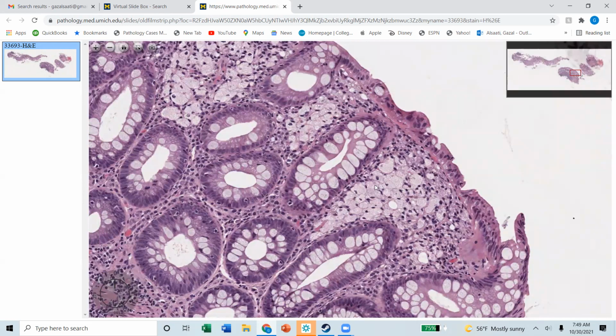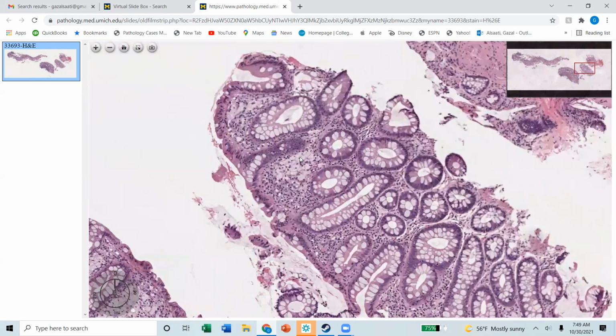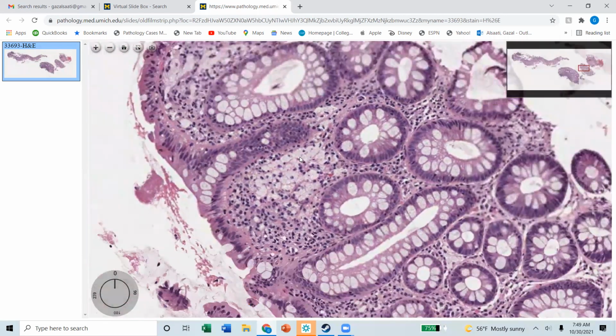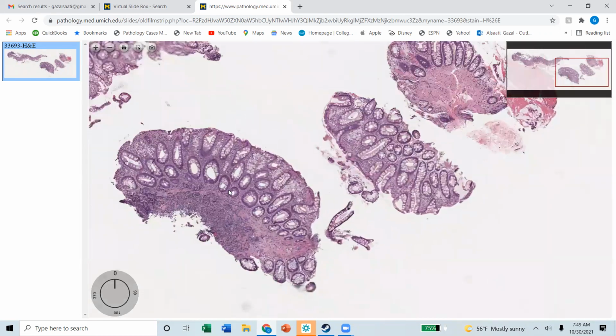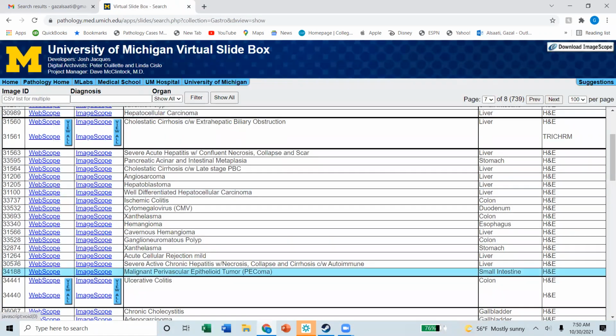These will be keratin negative and CD68 positive, and you'll call this consistent with the clinical impression of xanthelasma. Why don't I just call it xanthelasma? Because surprisingly, even if the doctor didn't see anything, you may see a lot of foamy histiocytes within the lamina propria, and the doctor doesn't call it anything. Not all the time will they be seen clinically, but when they are, they are more nodular like that. Just keratin and a CD68 should do the trick.